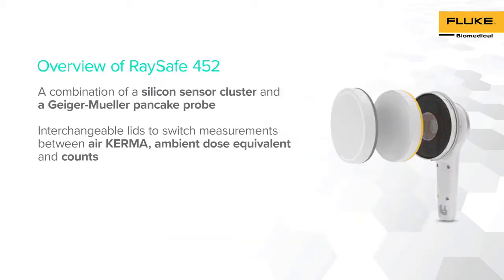RACE-A 452 consists of a combination of two types of survey meters: silicon diodes and a Geiger-Mueller pancake probe. This instrument has two interchangeable lids to switch between different modes such as air kerma, ambient dose equivalent, and counts for alpha, beta, and gamma radiation.